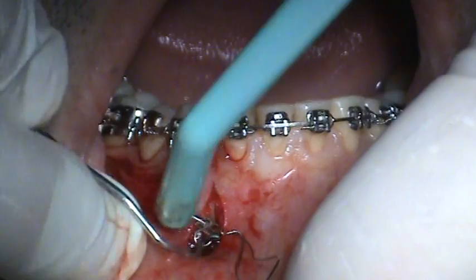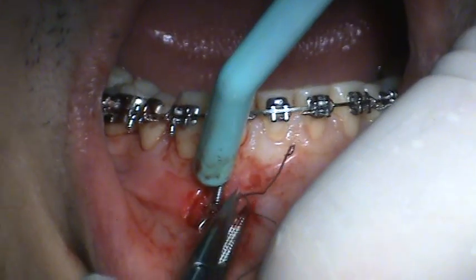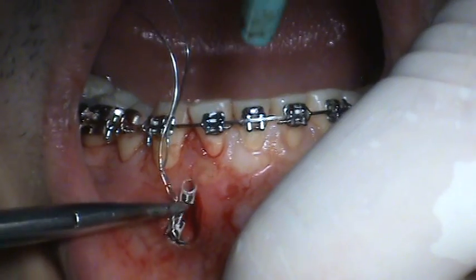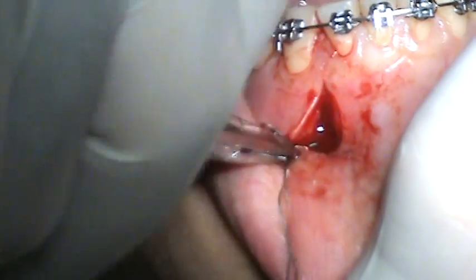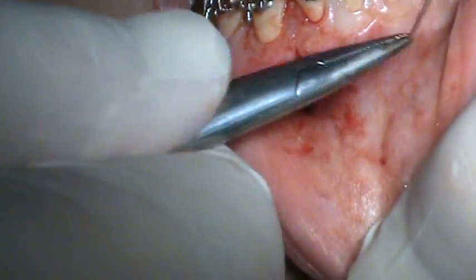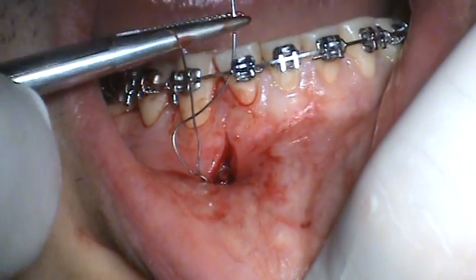Actually, we are going all the way to the bone plate. There is no reason to try to save a millimeter — we are going all the way to the bone plate. Now the end of this wire is our suspension wire.